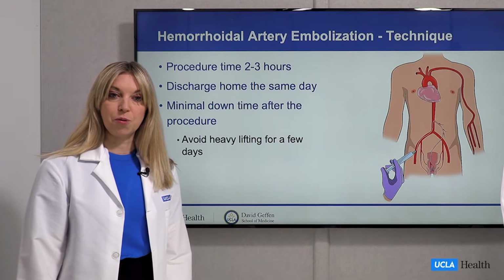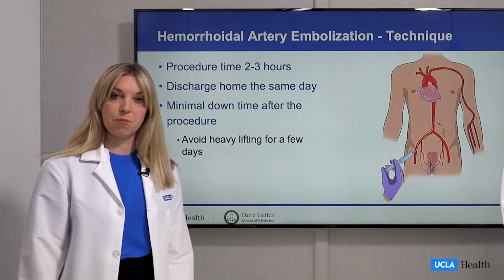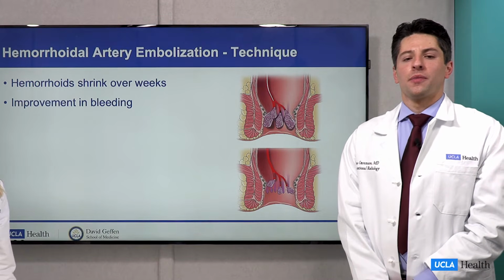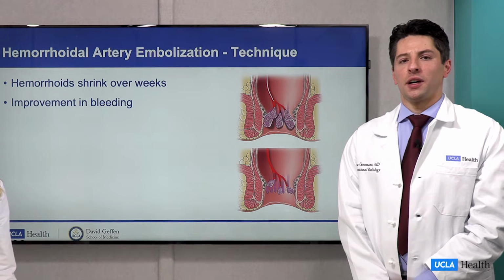Patients are discharged to home the same day, and there's minimal downtime after the procedure, while we do want you to avoid heavy lifting for just a few days after the procedure. Over the next several weeks, the hemorrhoids begin to shrink in size. We expect an improvement in hemorrhoid-related symptoms, especially bleeding, during this time.